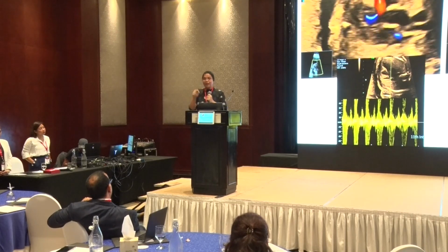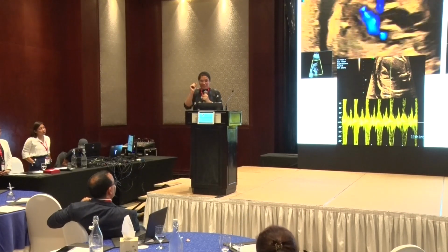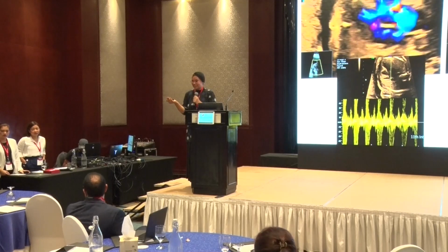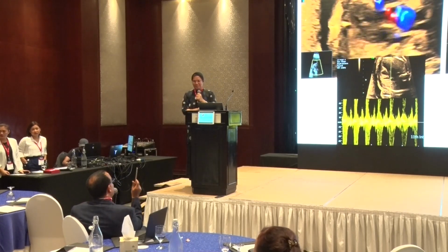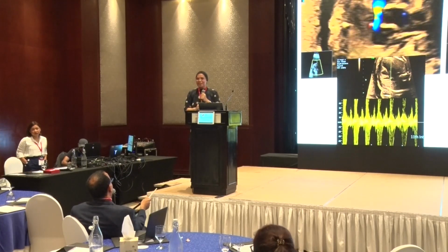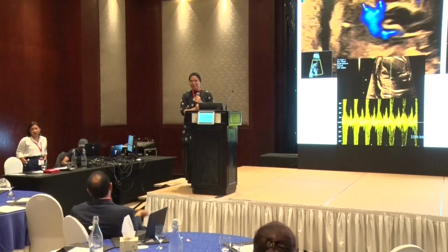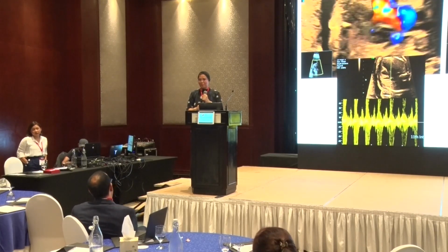Dr. Suleiman, I can't reproduce it. You have taught me that I should reproduce it if it is really there. That I couldn't reproduce. Yes. This is the beauty about fetal cardiology, to be honest with you. I can make any picture look abnormal, and I can make anyone look normal. I can make a four chamber view look hypoplastic, and I can make hypoplastic look normal, with a little modification and playing with how I am going to cut.